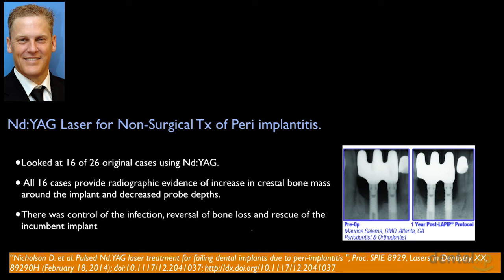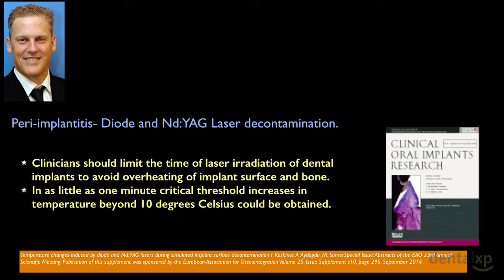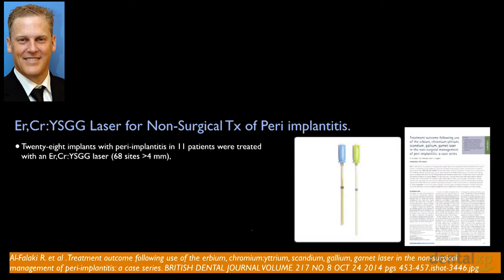And the conclusion was that there was a control of infection in all cases, reversal of bone loss, and rescue of the incumbent implant. Again, done in a closed flap nature. But remember, please be careful, because using lasers for a long time underneath a flap can cause increases in temperature. And studies have shown that in 1 minute or less, you can reach beyond the critical 10-degree threshold that can be damaging both to your fixture and to the surrounding bone.